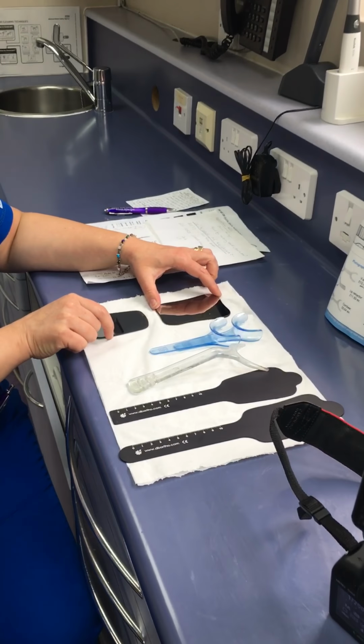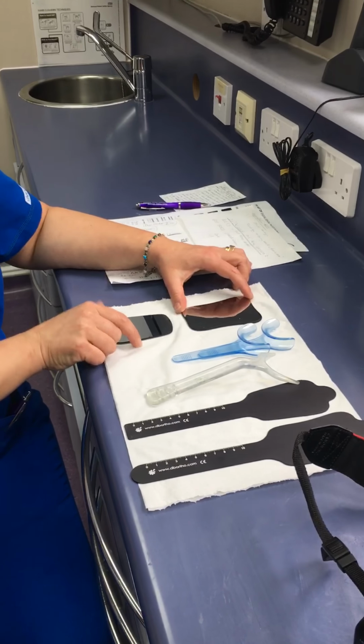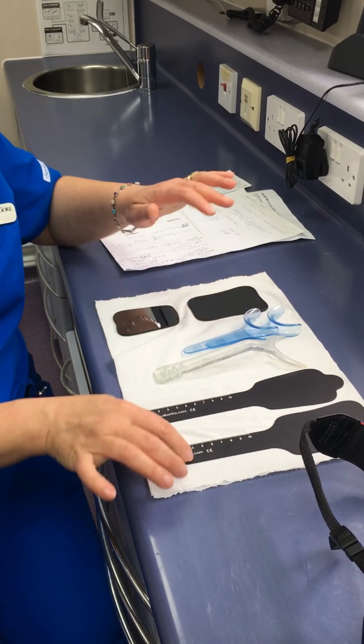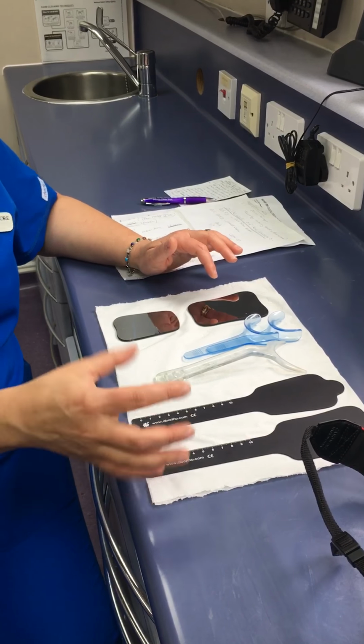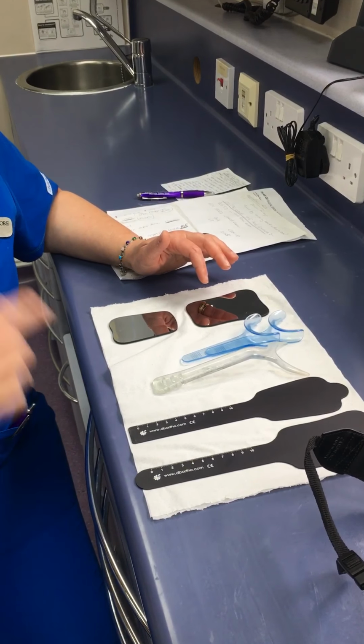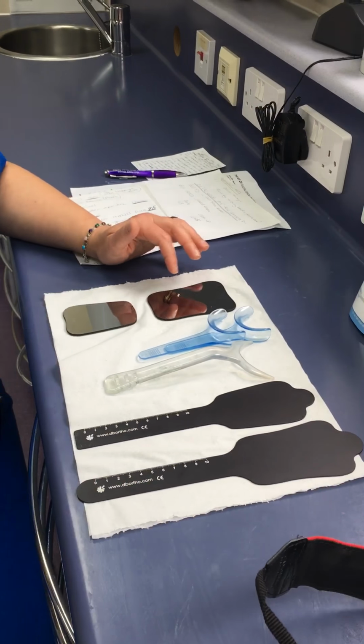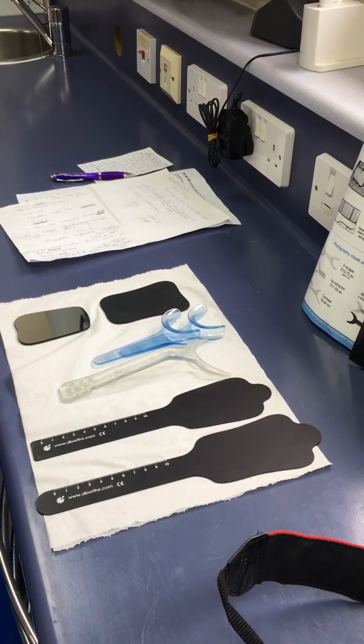You can have your mirrors for the upper and lower occlusal views, your cheek retractors, lip retractor, and these are called contrasters. Say for instance if you've done an anterior filling, then you could have a contraster against it to do the photo very nicely.